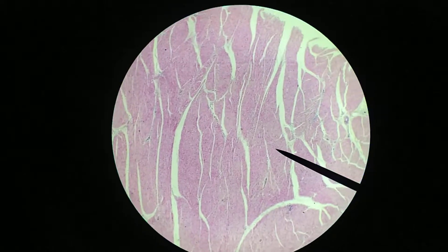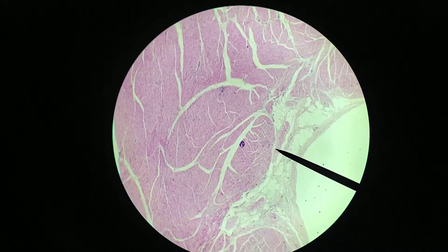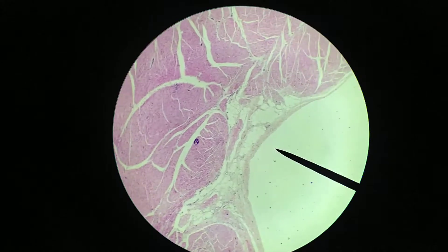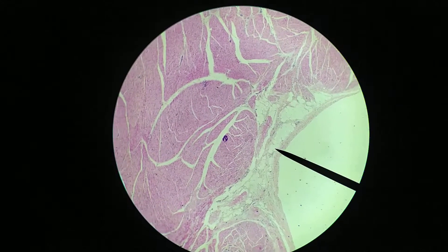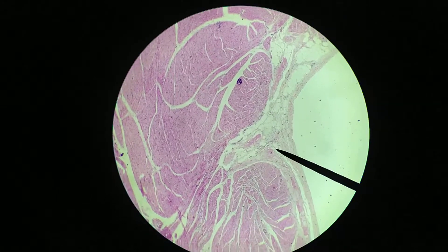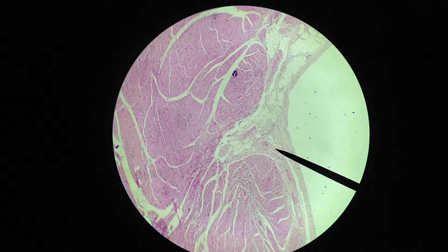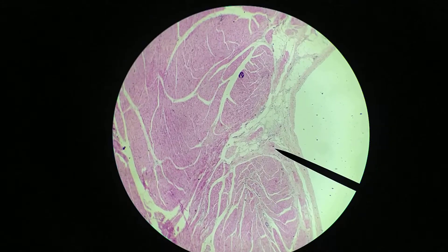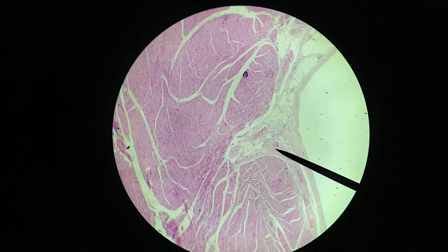There's one more area I want to show you, which is in this area here. This is the endocardium, and this is where we're going to be looking for Purkinje fibers. Right here is a cluster of Purkinje fibers. This may not seem like a lot right now — you may not be able to see much detail — but we'll zoom in on this so you'll be able to see Purkinje fibers.